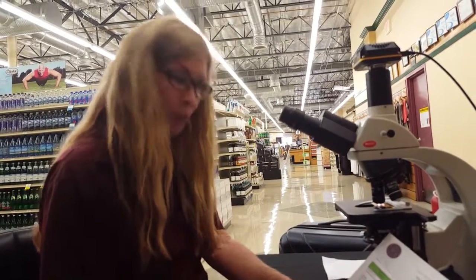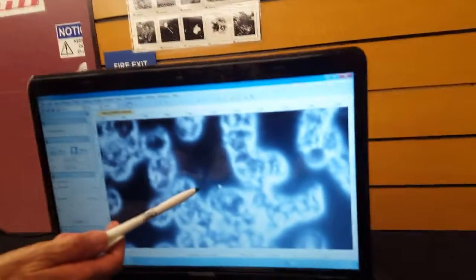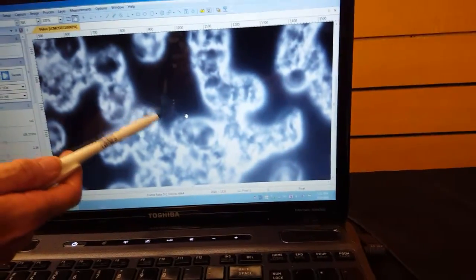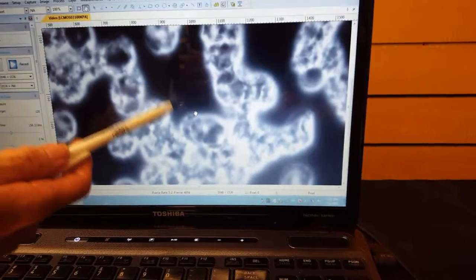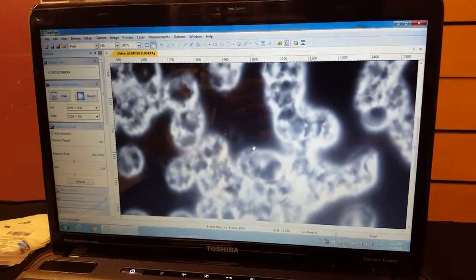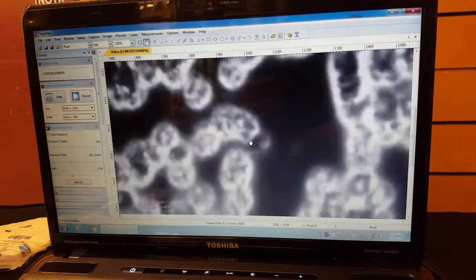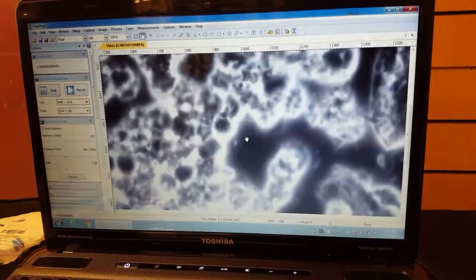So that's pretty much how it works. And then customers, they ask me questions and stuff. And now this might be right here. That might be a little bit of a candida thing right there. See that light shadowing? Yeah, that probably is. And that's a lipid floating there. It just floated by. Let's see. Yeah, you need a paracleanse.